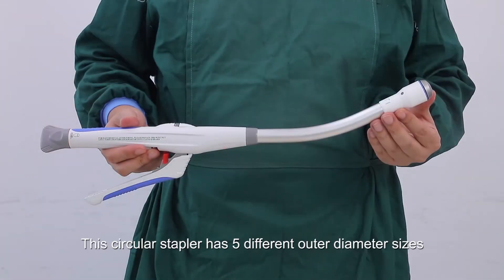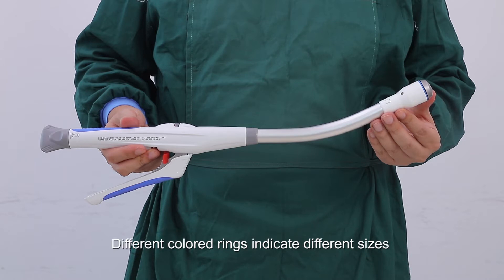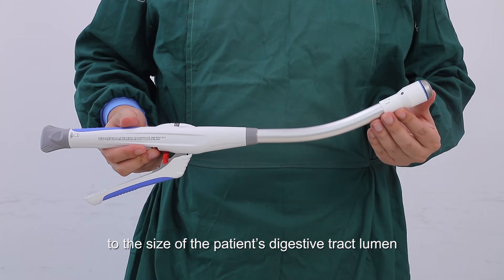This circular stapler has five different outer diameter sizes: 21mm, 25mm, 28mm, 31mm, and 34mm. Different colored rings indicate different sizes — gray for 21mm, white for 25mm, blue for 28mm, green for 31mm, and yellow for 34mm. Surgeons can choose a suitable size according to the patient's digestive tract lumen.